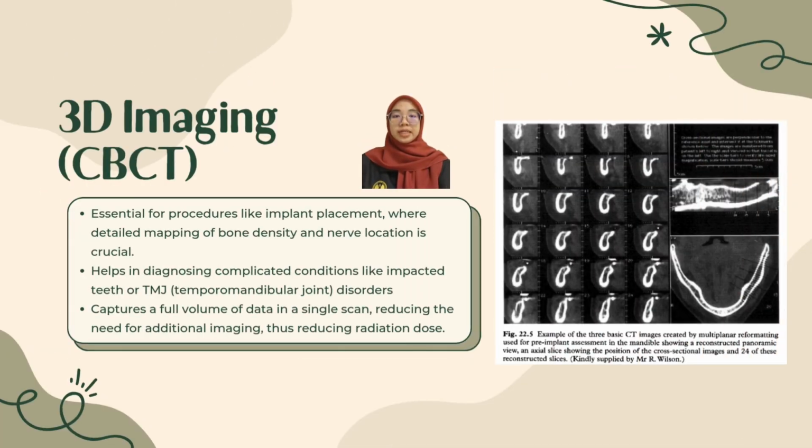Finally, advancements in 3D imaging, particularly cone beam computed tomography (CBCT), have revolutionized dental imaging. CBCT provides detailed three-dimensional images of the oral structures in a single scan. This reduces the need for multiple scans, minimizes radiation exposure, and enhances diagnostic accuracy. It is especially useful for diagnosing complex conditions like impacted teeth or TMJ disorder, where precise data is critical for effective treatment.